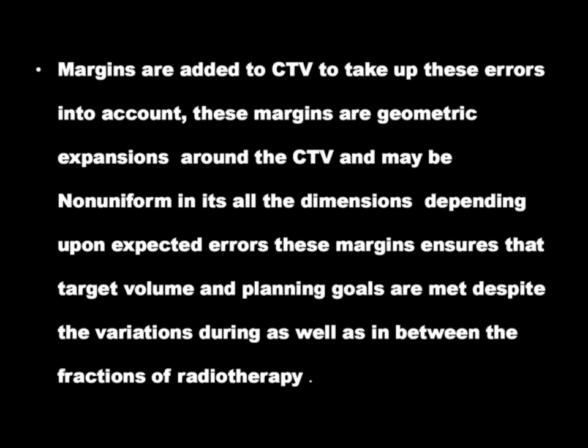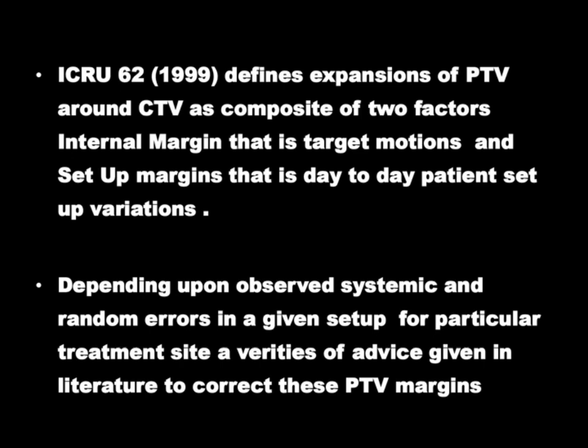So assumption about the expected range of organ motion leads to tumor motion, with the belief that the assumption holds true for all patients during the daily treatment fractions of radiotherapy. Although we know the individual has movement of a tumor, like in a prostate tumor after bladder and rectal refilling, the movement may be different for different individuals. So we cannot predetermine values that we should incorporate here.